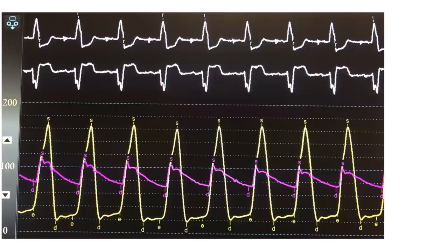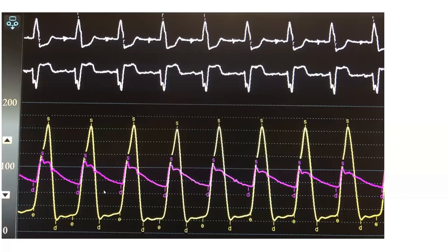I will start with this tracing. This is a simultaneous LV aortic pressure recording. I want you to look at this and try to think what is the diagnosis. Normally when you see a simultaneous LV aortic recording, there are two big diagnoses that should come to mind whenever there is a difference between the LV and aortic systolic pressure: one is aortic stenosis, the other is dynamic LV-OT obstruction. Which one is this?